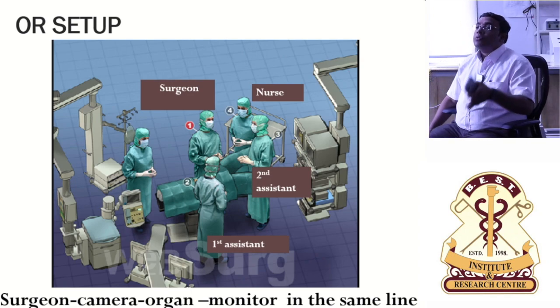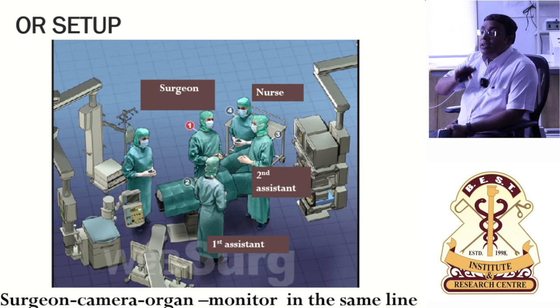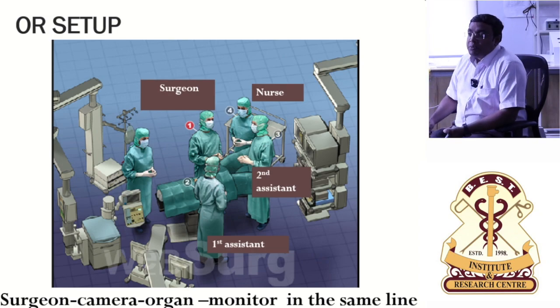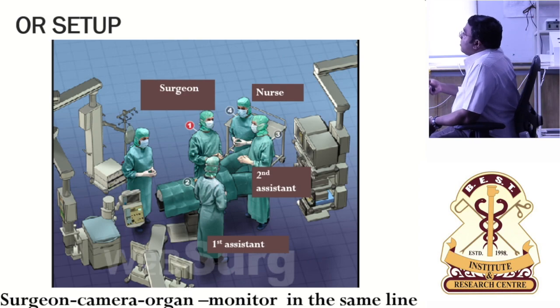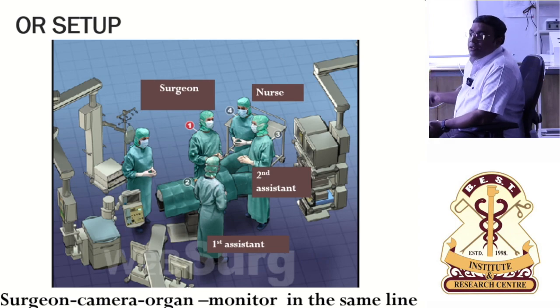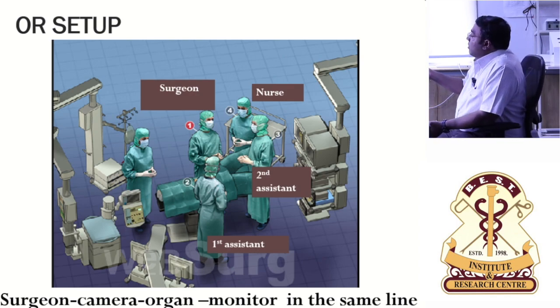You are not doing a good job when you are standing in an ergonomically irrational position. You should always be in the right position, then only you will be able to do a better job. So this you would have seen. For any hysterectomy, low lithotomy position is given with just a slight stirrups in the position in such a way that only the legs are flexed and widened apart. Not too much flexion is happening at this level.